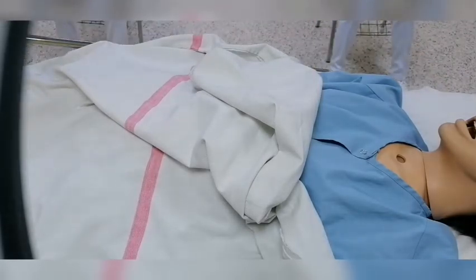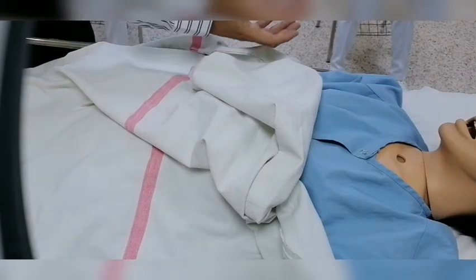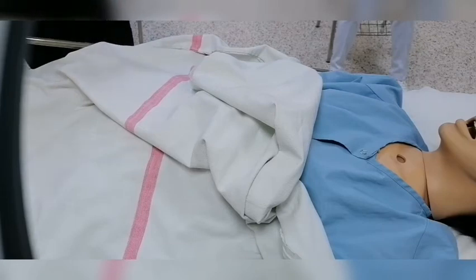Then I have to come to my client. I have to introduce myself. I am Yusuf Abu Khadra. I am your nurse today. I will do dressing for you. Is it okay? He will say, yes, you can do. Or he might say, please, can I have it later? So it depends upon that.